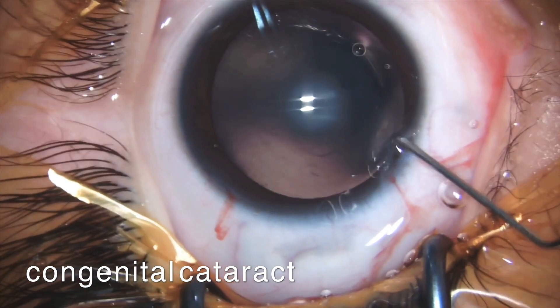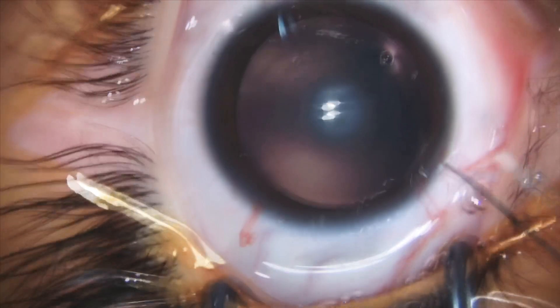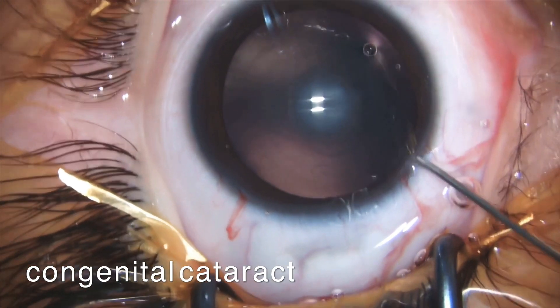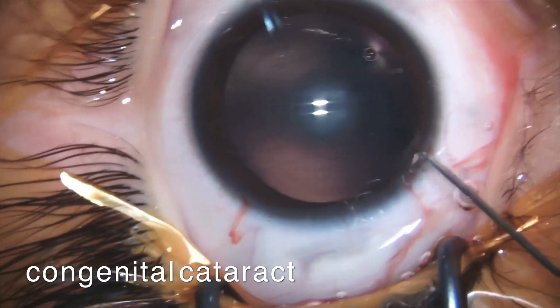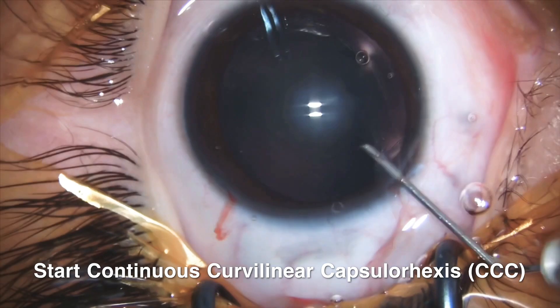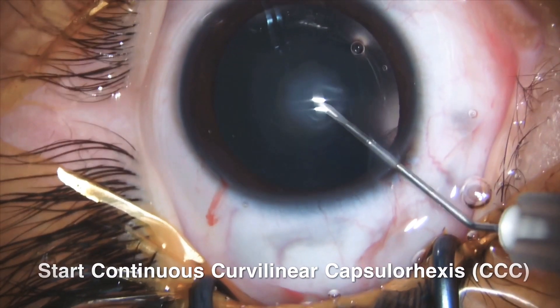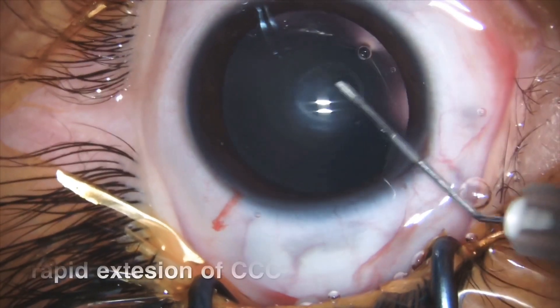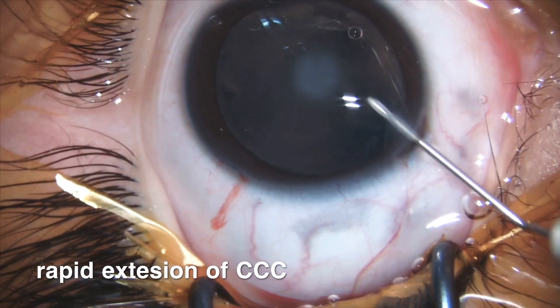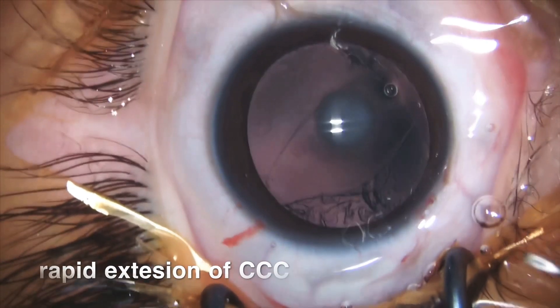Let's begin the case. After creating the main incision and filling the AC with OVD, as soon as I touch the anterior capsule, the 'bomb' explodes.